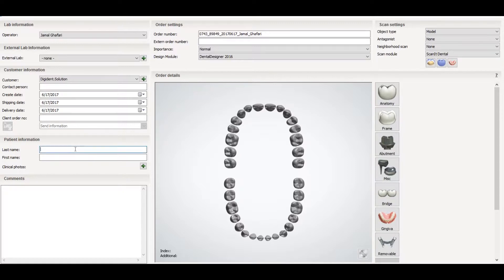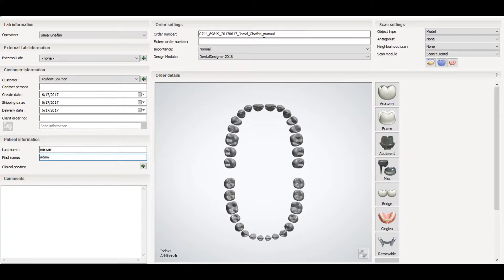In the patient information you can write the first name of the patient — you can see it appears here. Then you can write the last name also. The last name appears on the order number. You can change this with your unique order slip number, perhaps your lab slips.